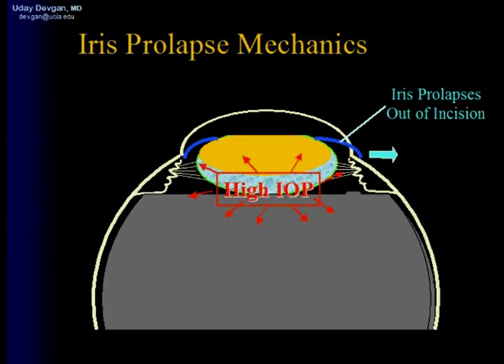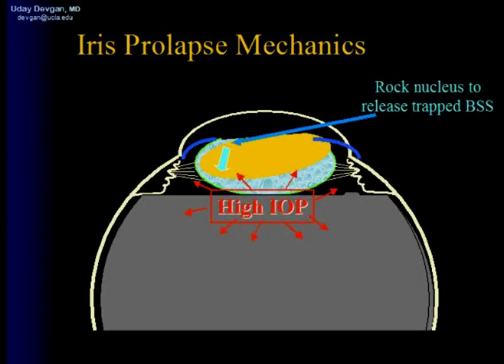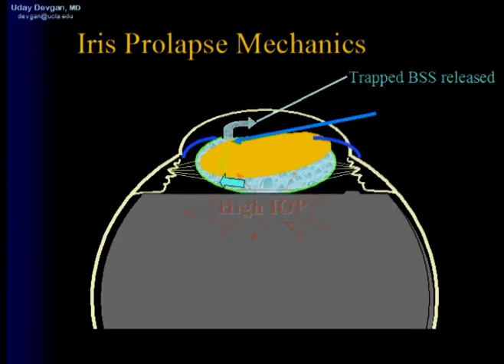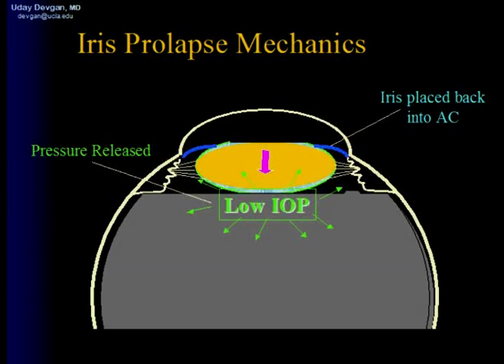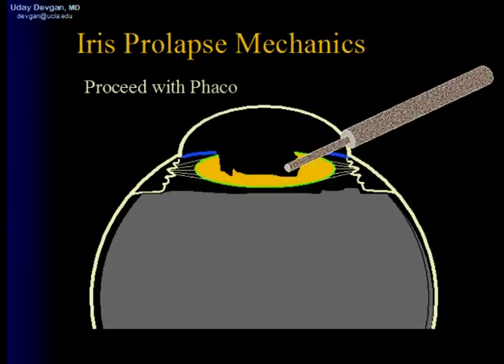The treatment of this is correcting the pressure gradient — rocking the nucleus to release this trapped balanced salt solution. As the balanced salt solution is released, the nucleus can now move posteriorly and the pressure is released. Now with a low pressure, the iris can be placed back into the anterior chamber and we can proceed with phaco. Let's watch this in action.